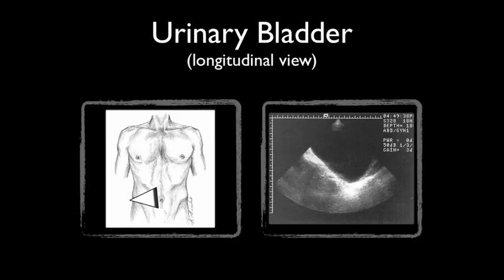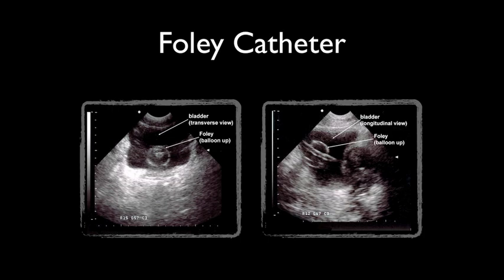This is the longitudinal, or sagittal, view of the urinary bladder. It appears triangular in shape. Make sure the indicator marker on the probe is toward the patient's head. Confirming the position of the Foley catheter is easy. In the longitudinal and transverse view, one can appreciate the Foley catheter and its balloon apparatus within the bladder.